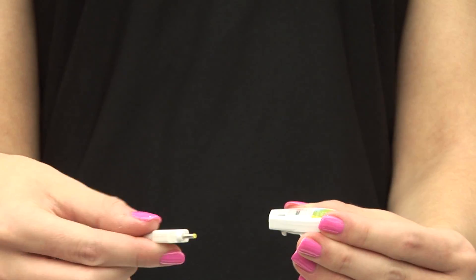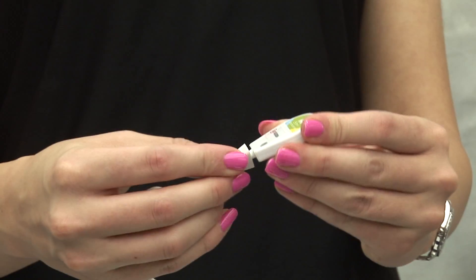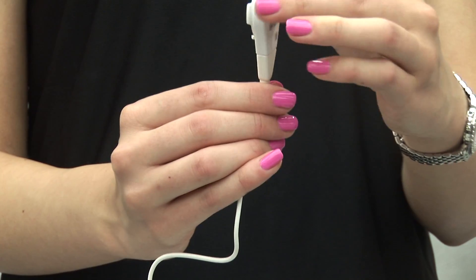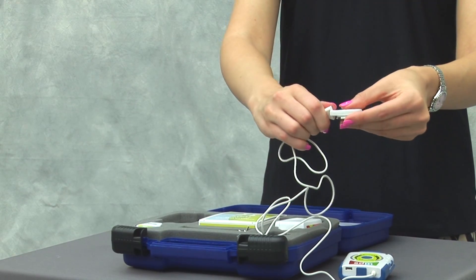To attach the applicator to the power controller, insert the power controller connector into the opening at the base of the applicator at a 45 degree angle. Turn clockwise until the surfaces are flush. The applicator is now connected to the power controller.